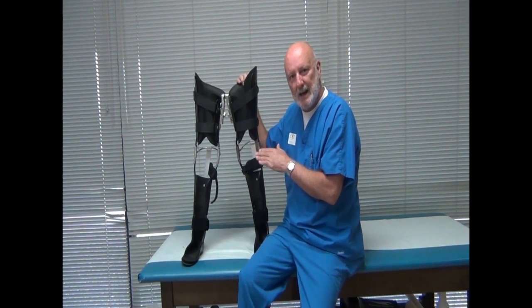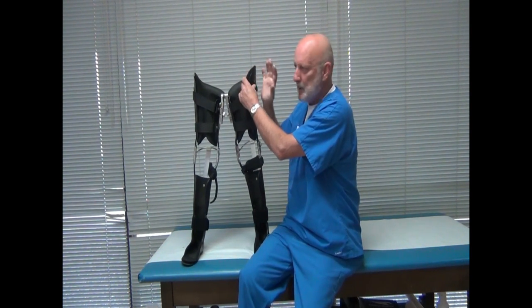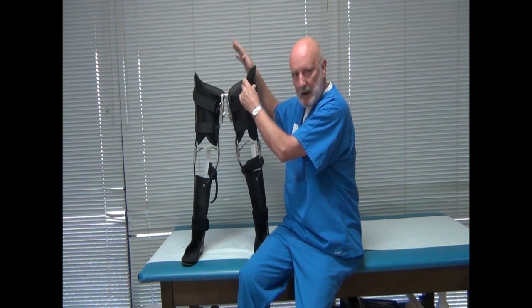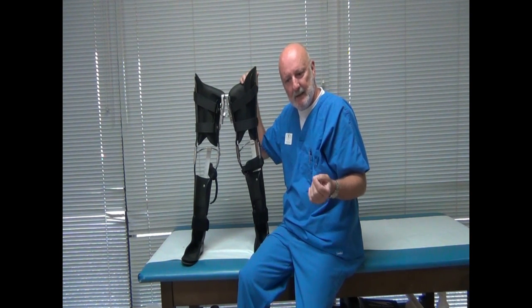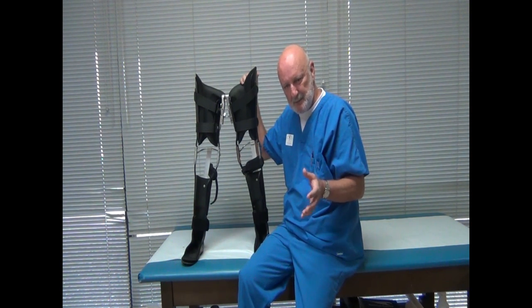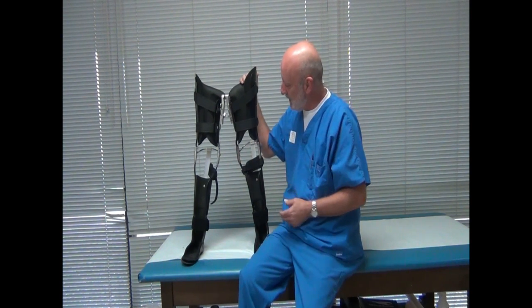This is an alternative design to a reciprocating gait orthosis, which is a much more bulky device that includes a large pelvic band and cables or a rocker bar that basically accomplishes the same thing. The RGO is a more stable, more durable system, but it is also a lot more bulky and heavy, and this is an alternative.